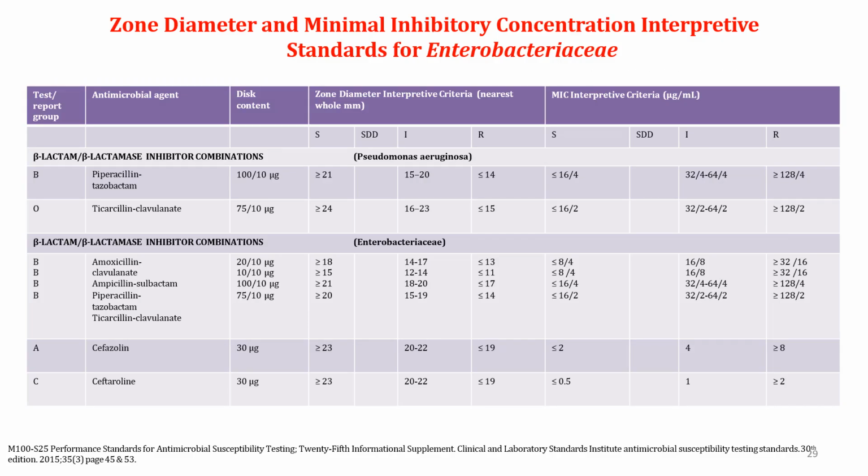So this is the CLSI chart that is used. Say, for example, for this organism Enterobacter, say the MIC by CLSI is about 6. If it comes between the intermediate and resistant breakpoint, then it will be interpreted as intermediate. If the MIC would have been 12, it would have been interpreted as resistant. If the MIC would have been 1, it would have been interpreted as sensitive. So it is all based on the breakpoints that the MIC is interpreted as sensitive, intermediate, or resistant.